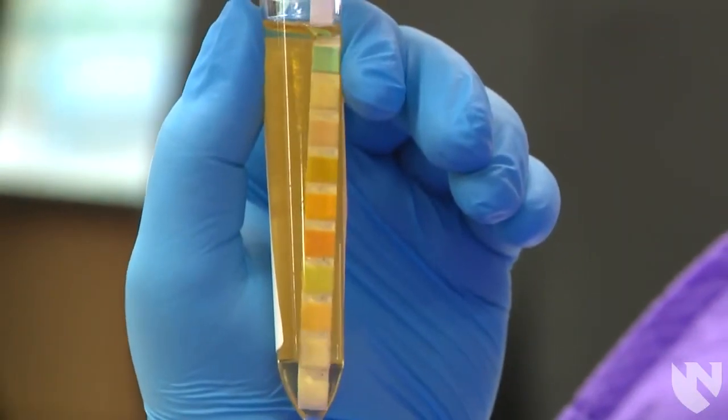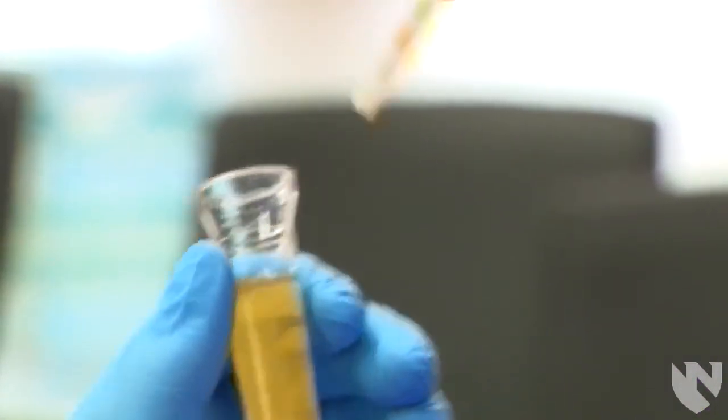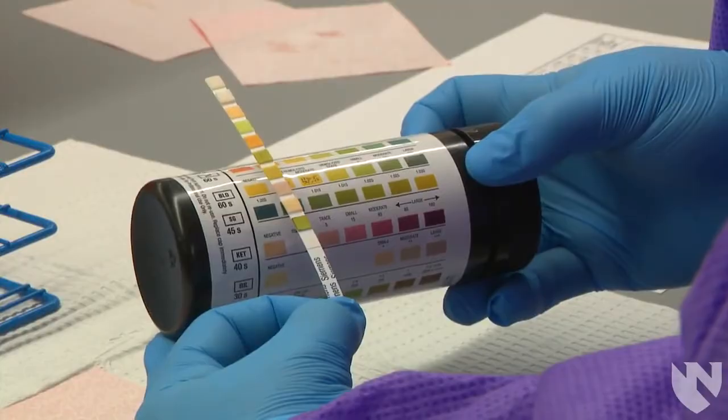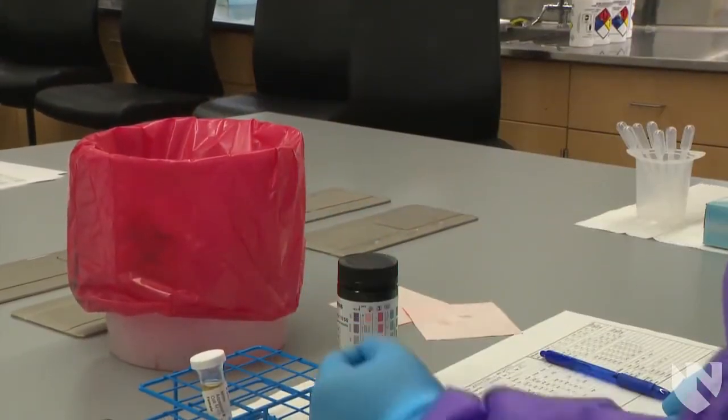The chemical reactions do not stop once they begin, so we cannot go back and read any of the previous reactions once the time has passed, or we could report falsely positive or increased results. When the test is done, dispose of the dipped reagent strip into a biohazard container.